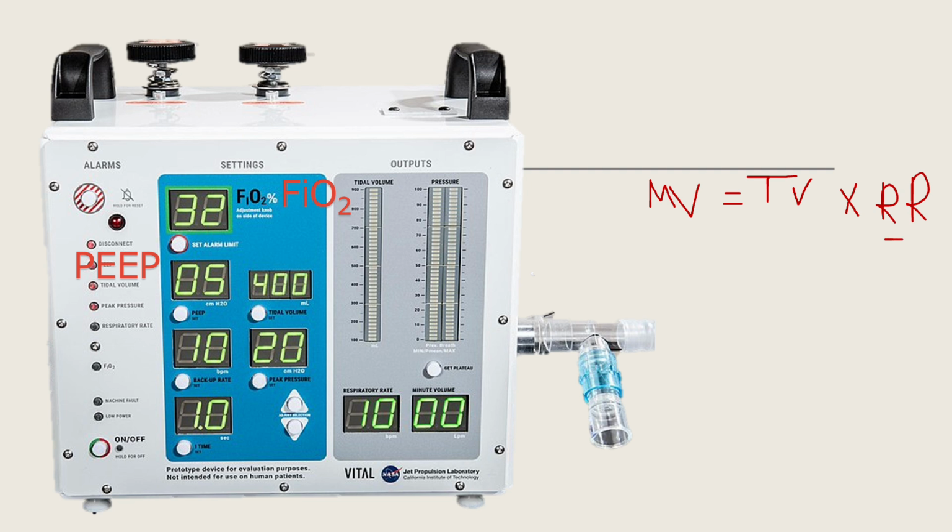So if you get the rate per minute and the volume per breath, you get the minute ventilation.